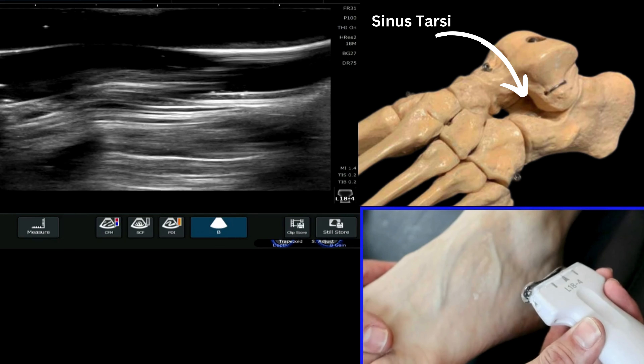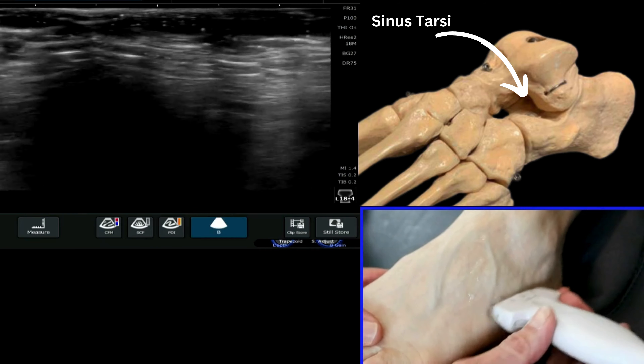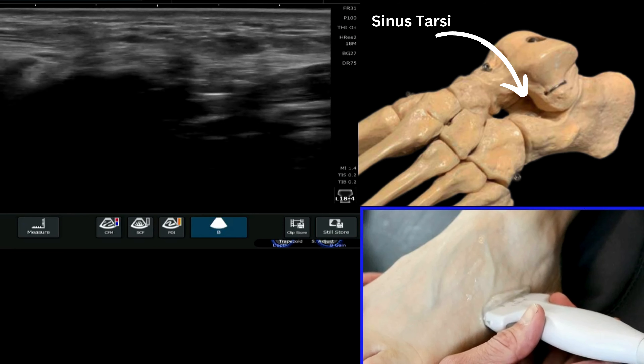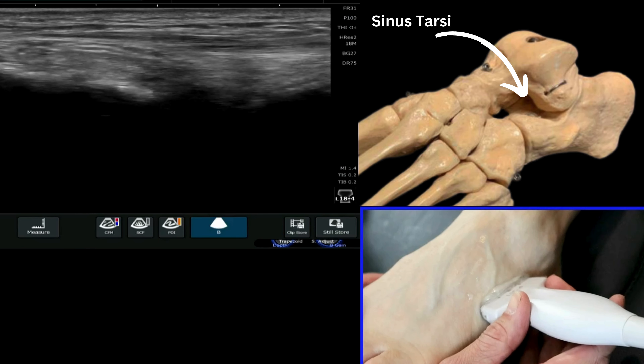We're now going to see if we can identify the sinus tarsi on ultrasound. It's good to have a systematic approach to this region, because ultimately it is a void — for want of a better phrase — between the calcaneus and the talus.